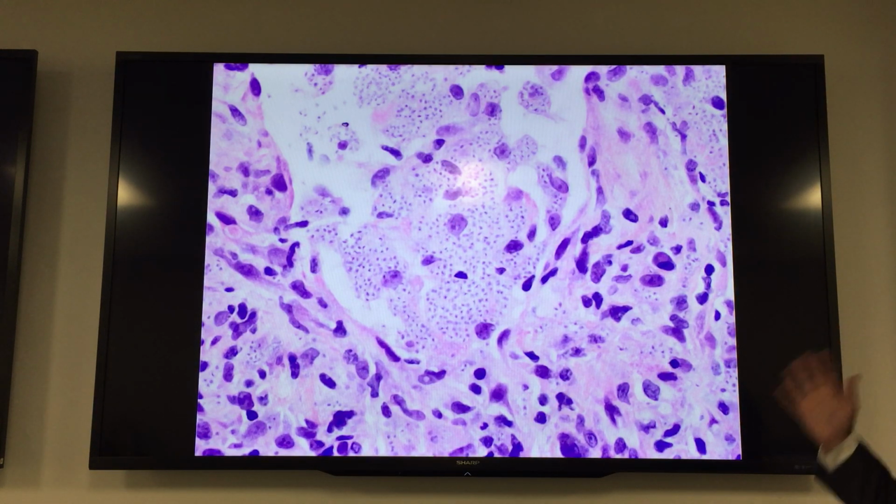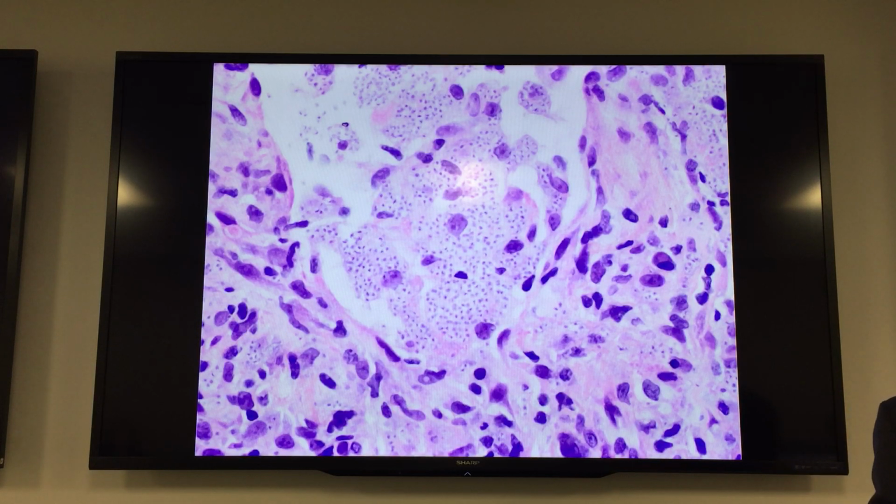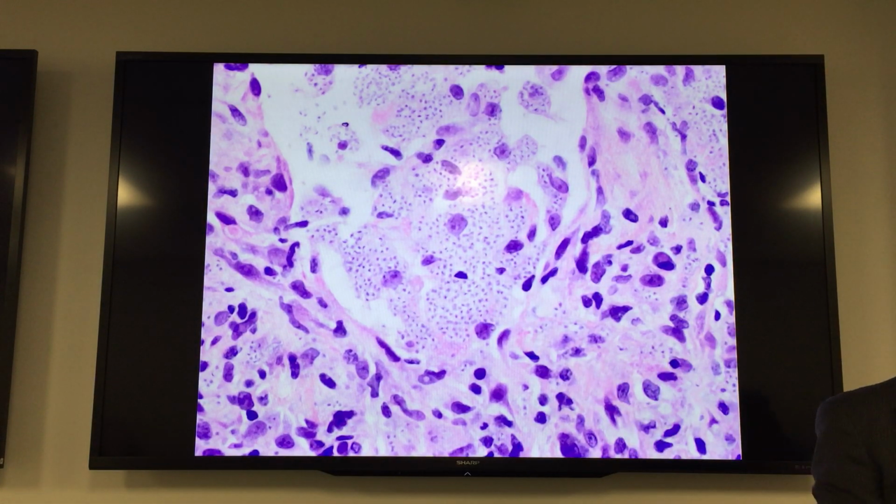There is a difference between the histology in disseminated histoplasmosis, where you have no immune system, and the bugs just get into the macrophages and become big like this. This is the classic histology of disseminated histoplasmosis, which is the fatal form of the disease. And what I showed you in the previous slide was the histology of just nodule-forming histoplasma in the lung, those old, healed histoplasmosis in which the bugs are dead. You can see them on the GMS, but they never grow in cultures. This is very bad. This will grow in cultures, this will kill the patient, and rarely you will see this in lung biopsies as well.